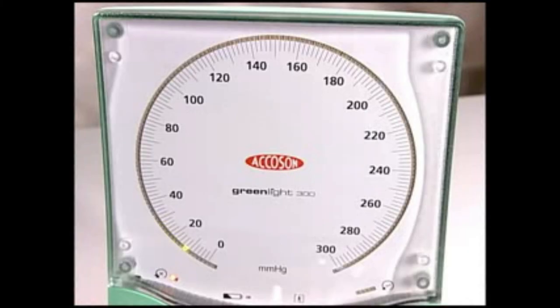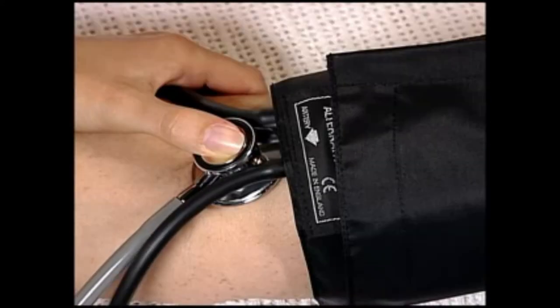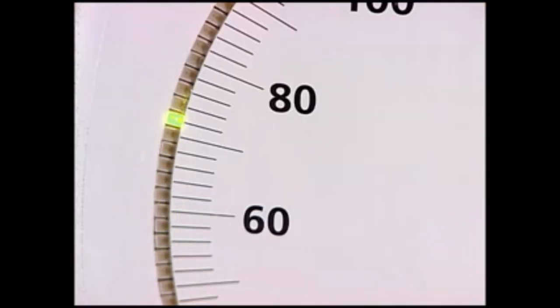Having deflated the cuff, rapidly re-inflate to about 30 millimeters of mercury above the estimated systolic blood pressure.